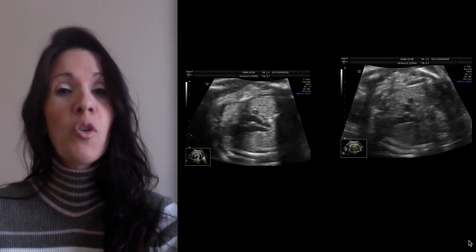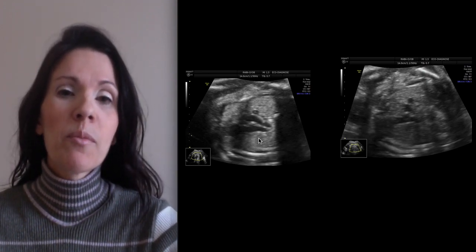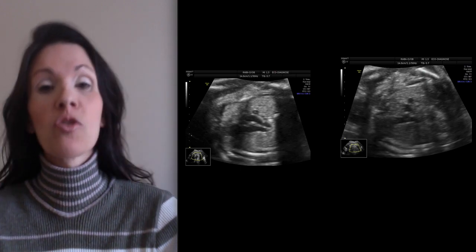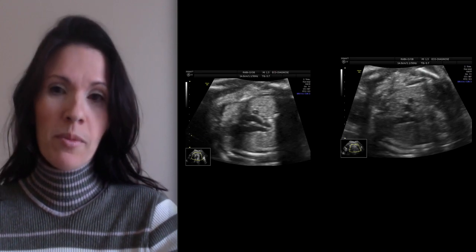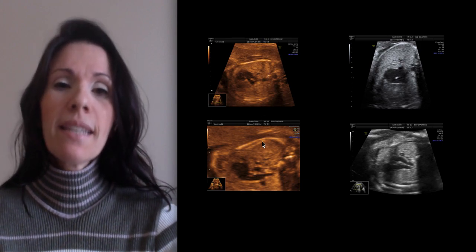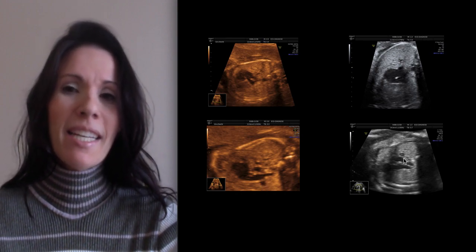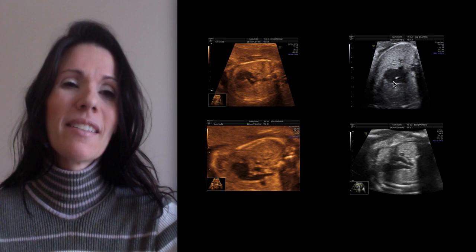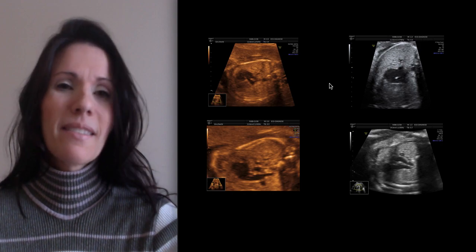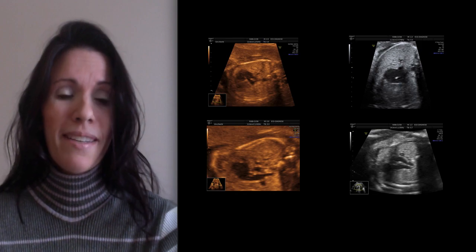And of course I got the 3-vessel view, and I could not see that fourth vessel, and this is normal, just to be sure about the septum primum ASD. And just to make a comparison, you can see this case was the previous one, persistent left superior vena cava, and this is the last one, septum primum ASD. Look, it's tricky. Believe me. Pay attention. Okay? Thank you.